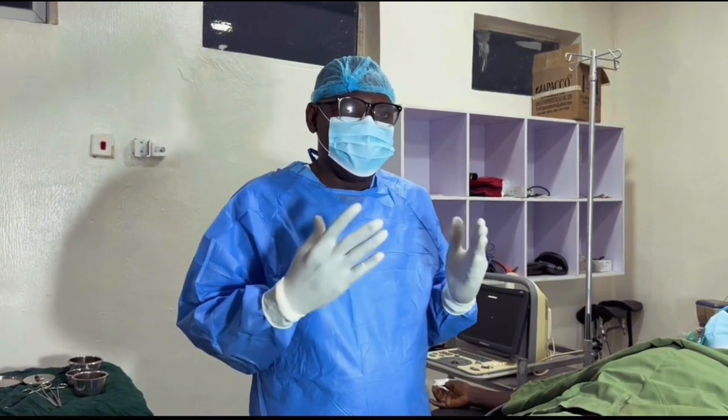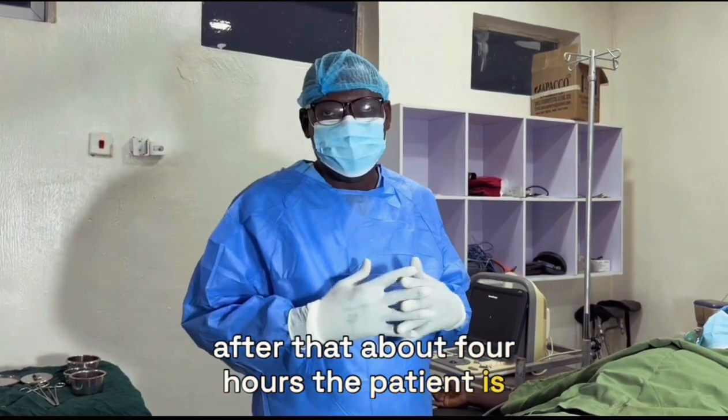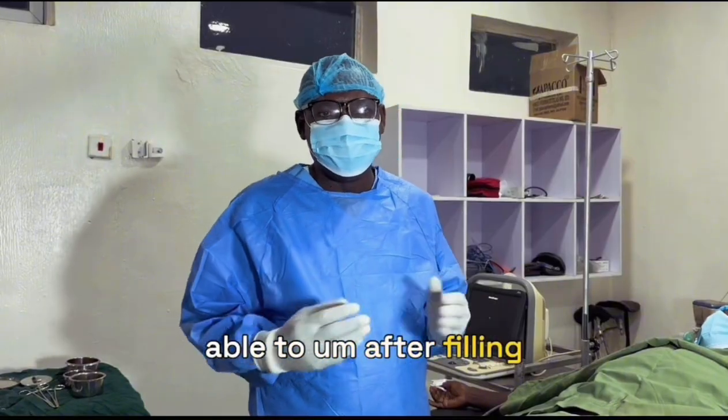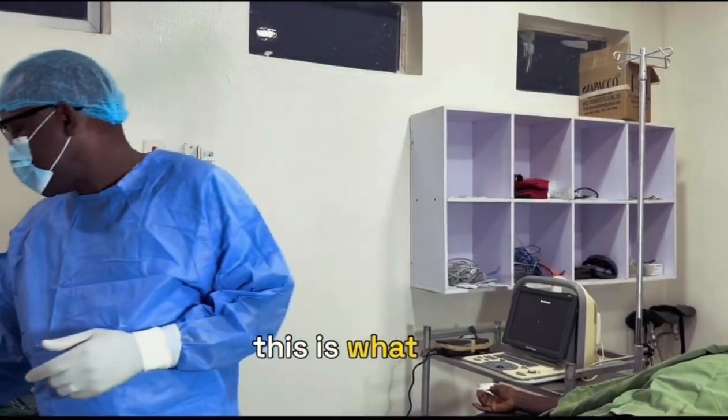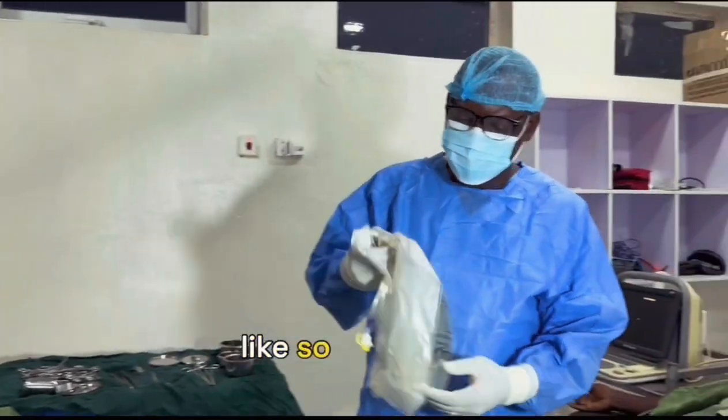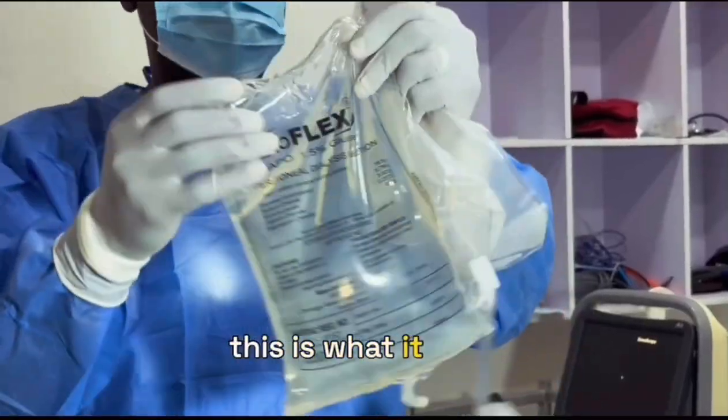After filling the peritoneal cavity with that 2 liters of peritoneal fluid, and this is what the total looks like. So this is 2 liters of peritoneal fluid. This is what it looks like. Okay? It is 1.5% PD fluid.